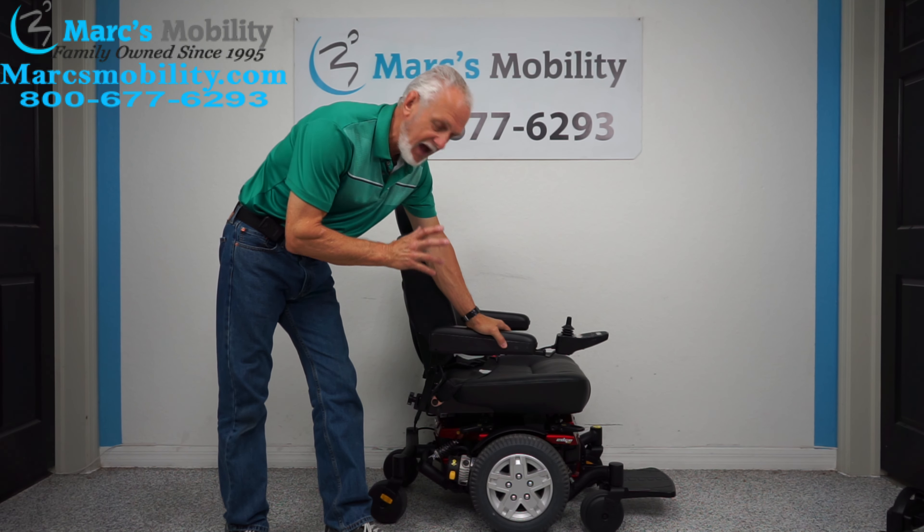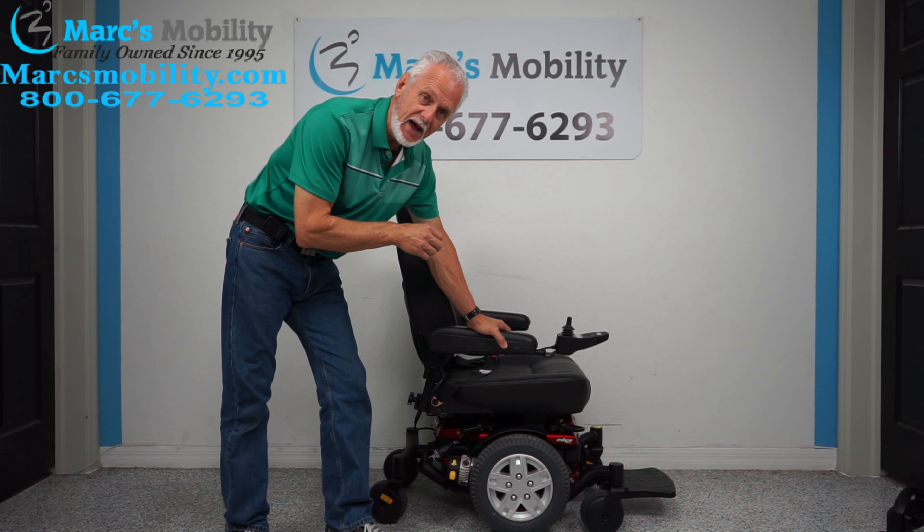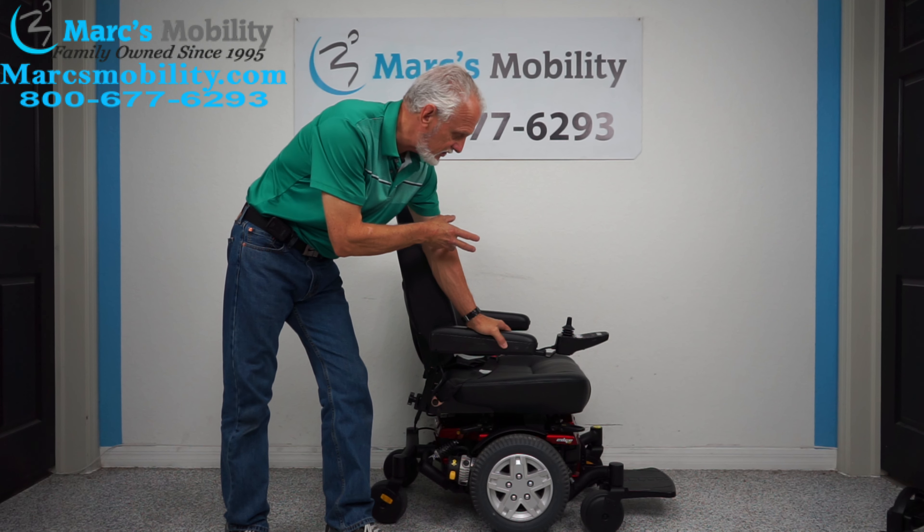Hi, so we have here a good looking heavy duty power chair. It's a Quantum Edge HD for heavy duty. This power chair has a weight capability of 450 pounds. It has the HD motor, it has the XL seat on it, the extra large seat.